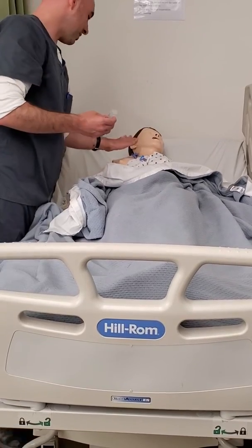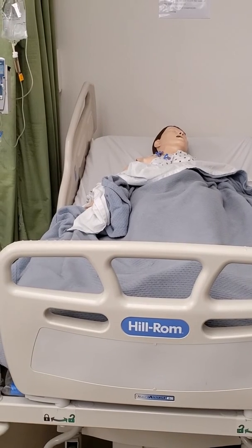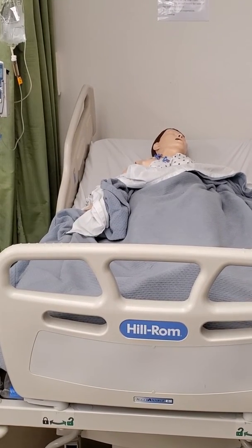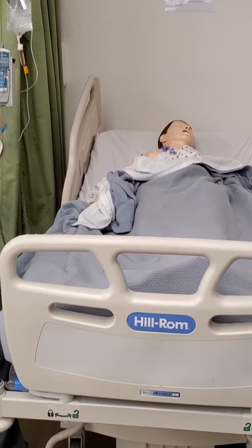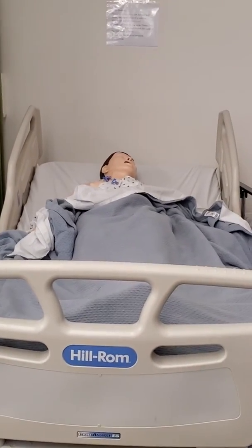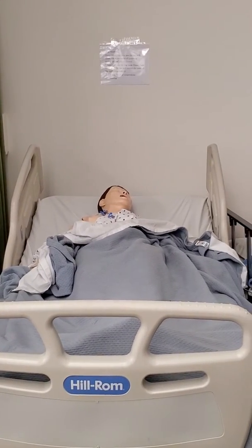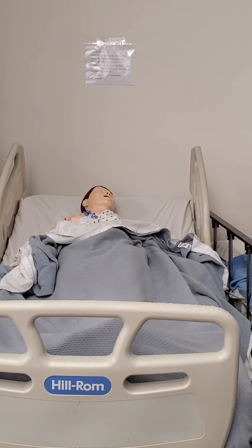Okay, so once I have that, I'll throw this in a sharps container. That was within my reach. My patient's bed is elevated, but it's not out of my field of vision. And so once I have patency in her central line, I can spike this bag. What do you want to do first?